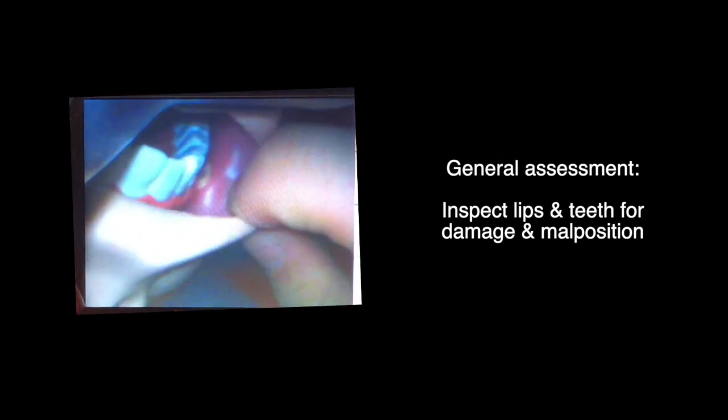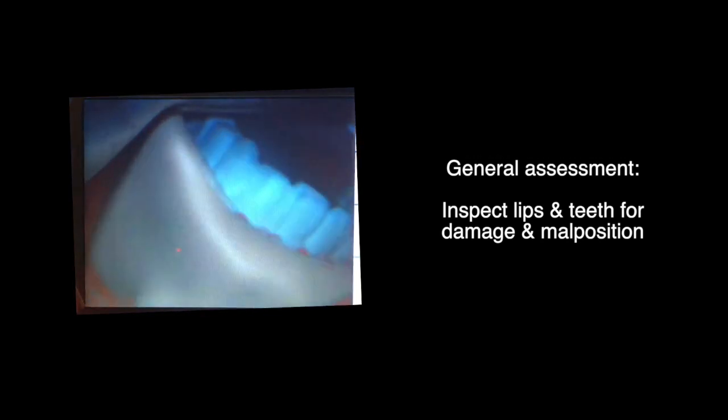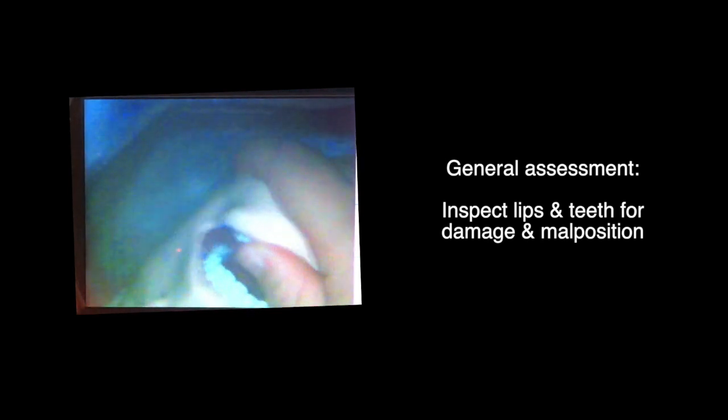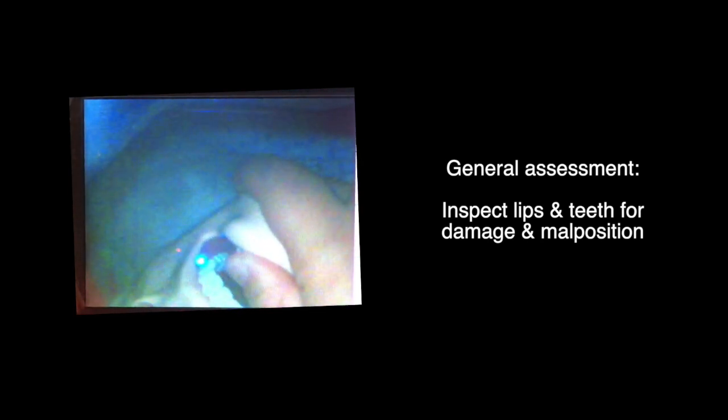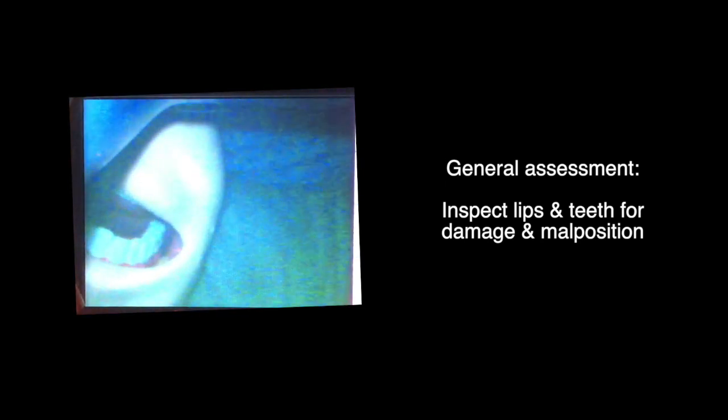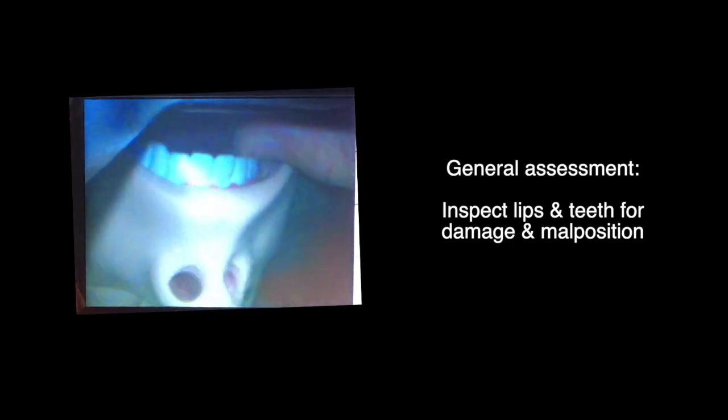Hello, let's take a brief view of the high-tech manikin's oral and airway structure and functional assessment. This shall be part of the manikin preparations and post-training housekeeping to ensure the manikin's operational status. Do let me know if I miss anything, and hopefully you can have a different point of view of the high-tech mannequins.